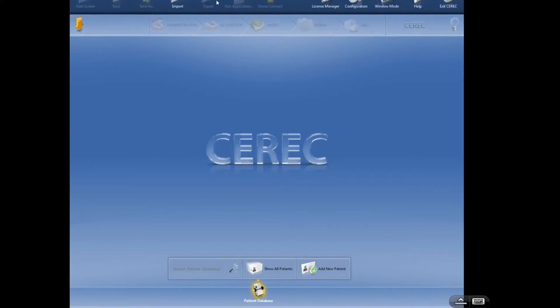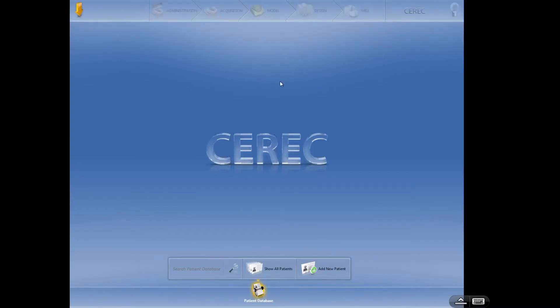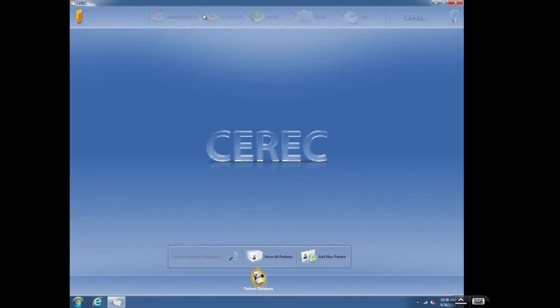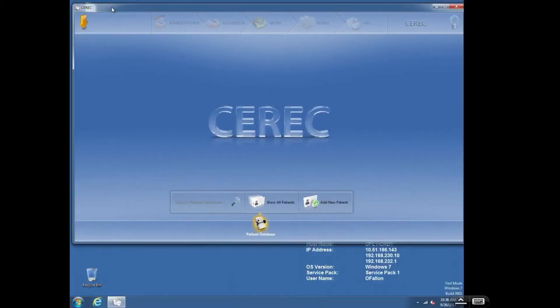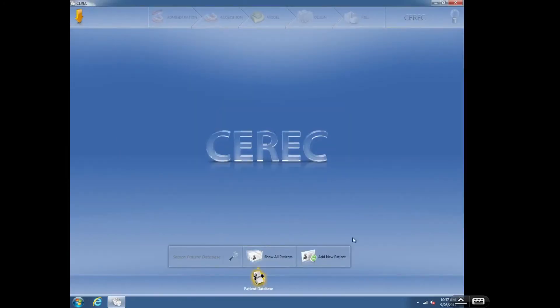This is your landing page. As I demonstrated before, I like to use the screen maximized — I just think it looks a lot cleaner. Now sometimes if we have a case going on and something milling and we need to get another case opened up, how do you add another CEREC case without closing the other one? The way we do that is to go to window mode. That brings back the bars up on the top. You can see I can grab it and drag it around. If I drag it up to the top, it'll maximize it to fit the screen, but it doesn't take away these control bars.